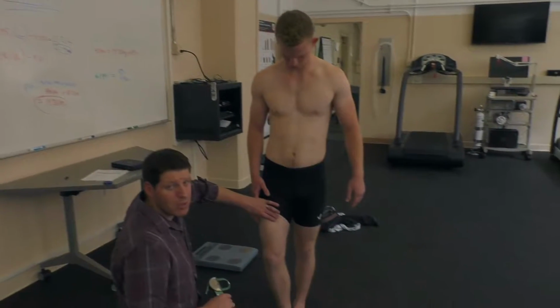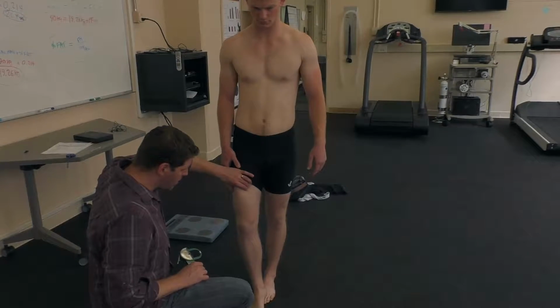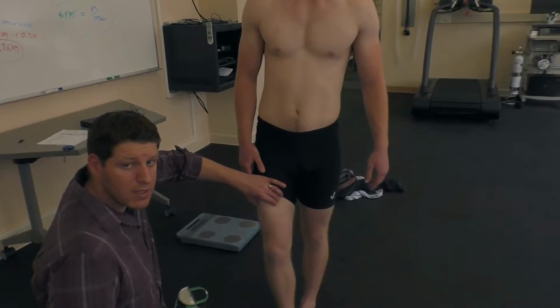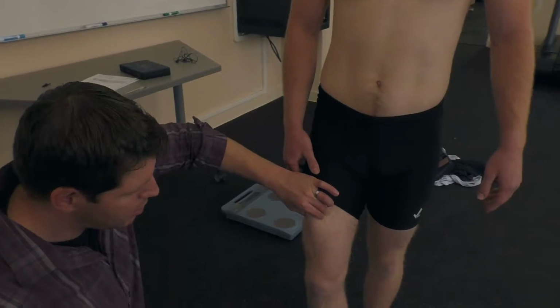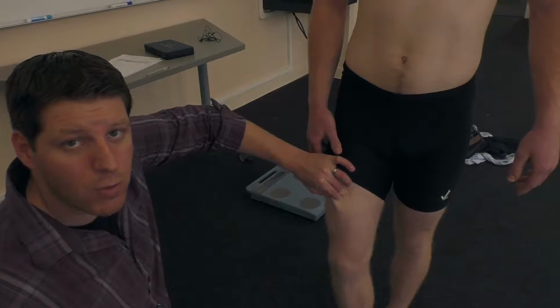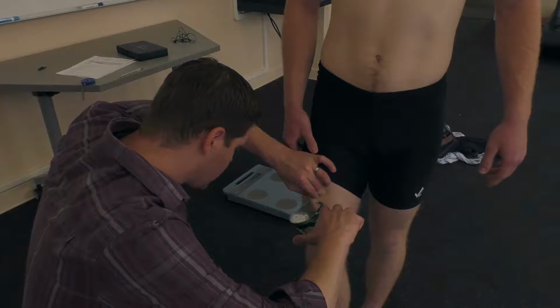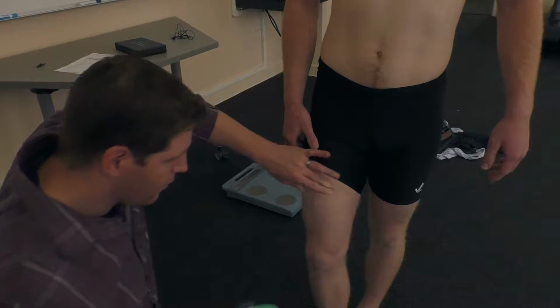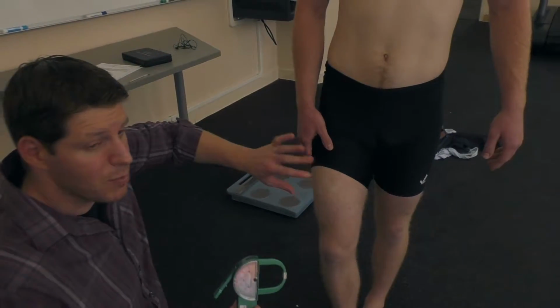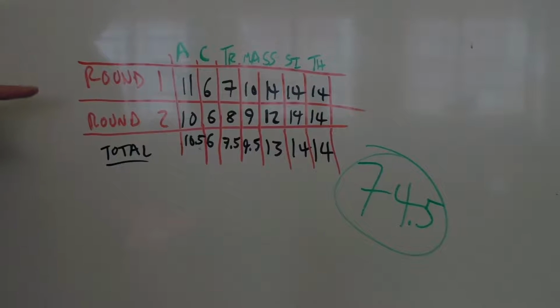Okay. This one can be really difficult because legs are often very muscular. So you want to make sure that you get really deep and get part of that muscle. Slowly retract the pinch, and you'll see it slip out. Okay, see that? So the muscle slipped out, and what remains is the subcutaneous fat. Reach in, take your skin fold, release the skin fold, and then release the pinch. If you release the pinch before the skin fold, it's going to hurt, right?